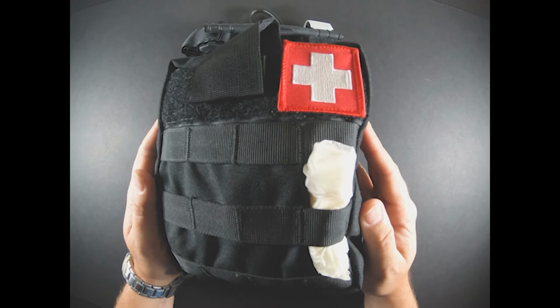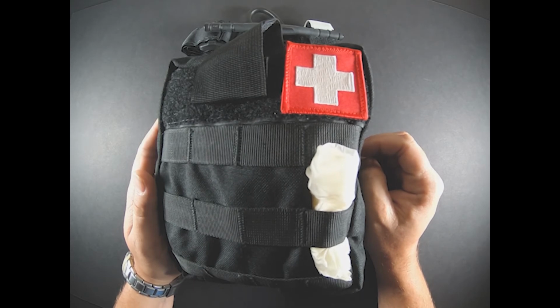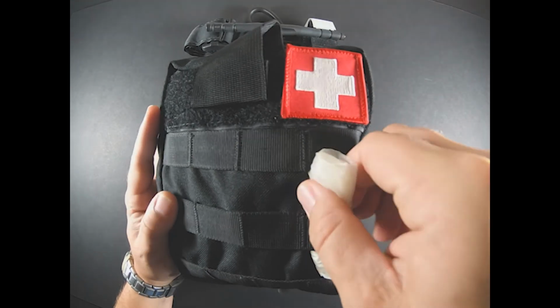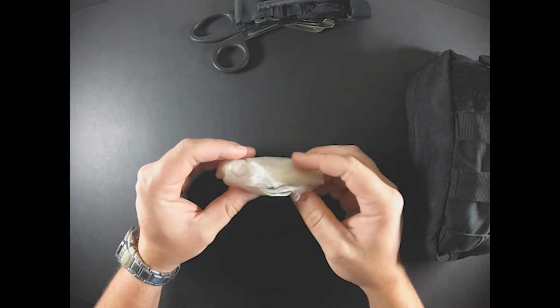So we'll start with the outside of the pack first. Let's talk about this here. That's just a good indicator. Every bag that has first aid in it should have something that indicates what it is. So that's what that's for. It just basically Velcros on. These here, let's push this aside. All right, I'll explain these later.